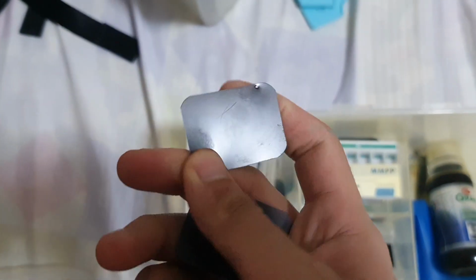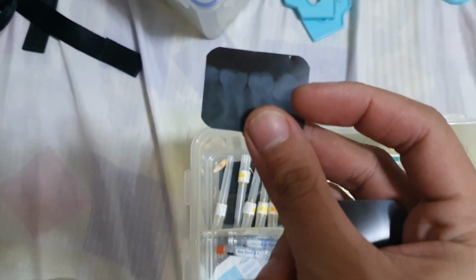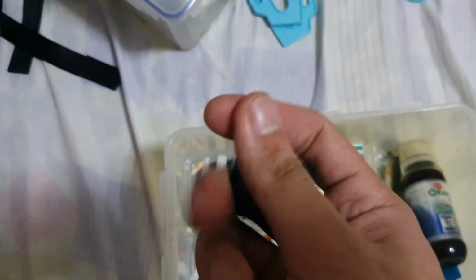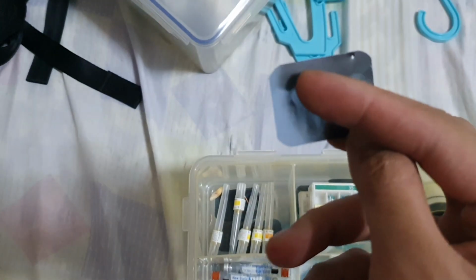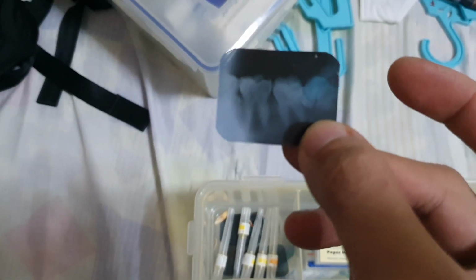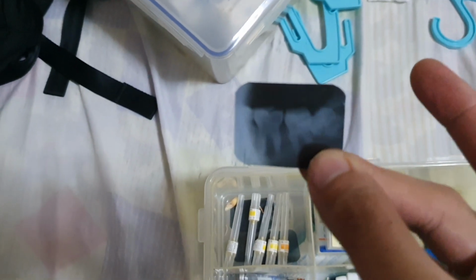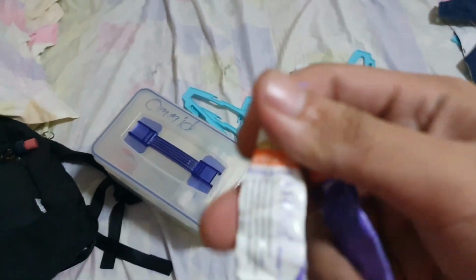And this is the x-ray. As you can see here, there is an impacted third molar, and as you can see here, the first molar is kinda effed up and needs to be root canaled. So yeah, and this is basically AH Plus.